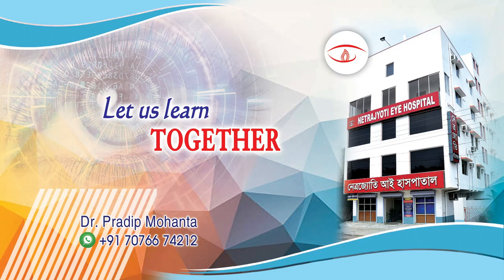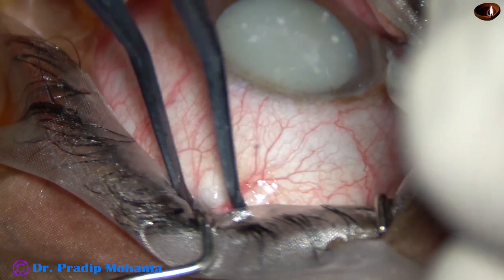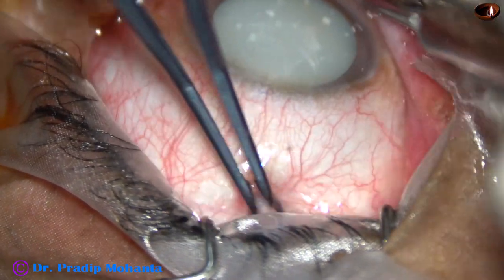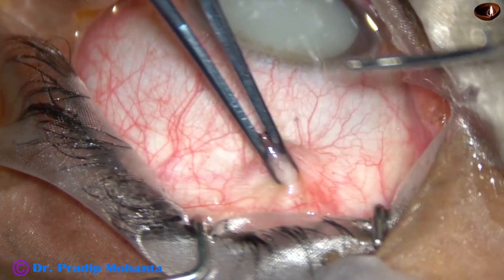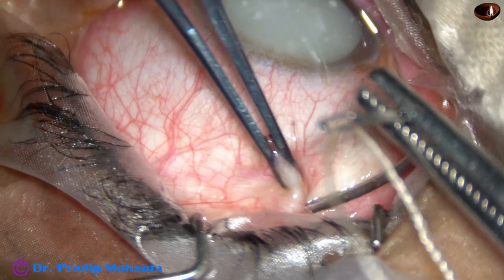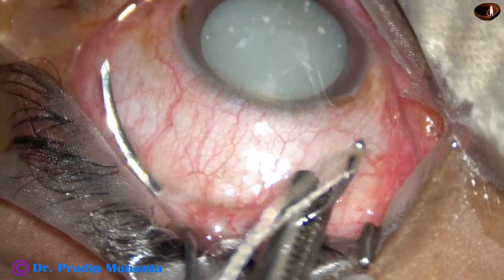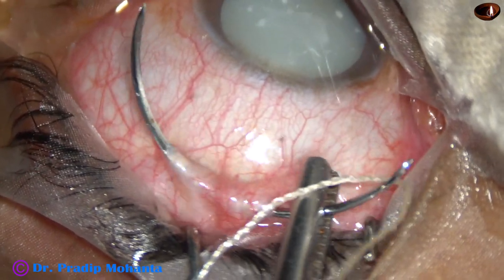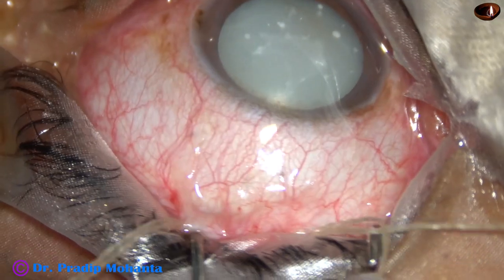Friends, welcome to my workplace at Ranaghat, West Bengal, India. This is a hypermature Morgagnian cataract. Let us do a safe surgery for this 80-year-old lady. The patient belongs to a very poor socio-economic category. Financial strength is very less; cannot afford phacoemulsification.